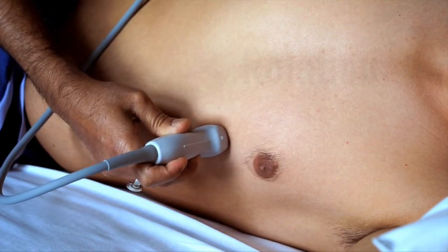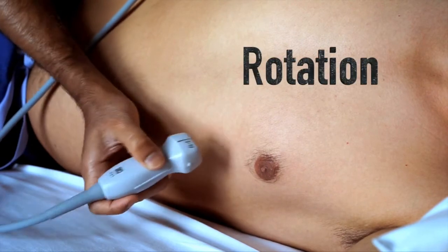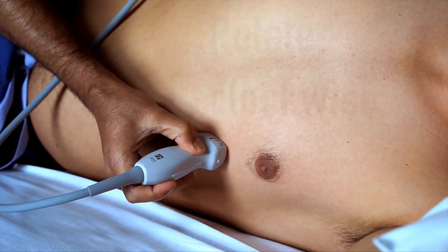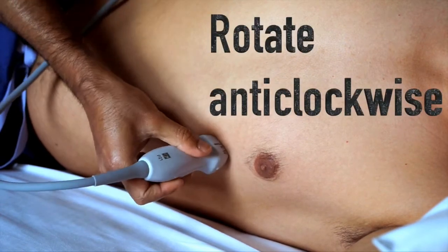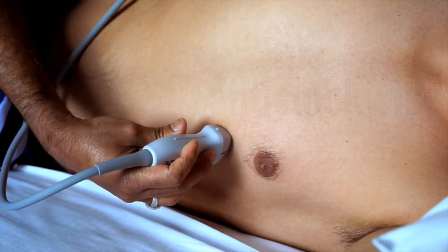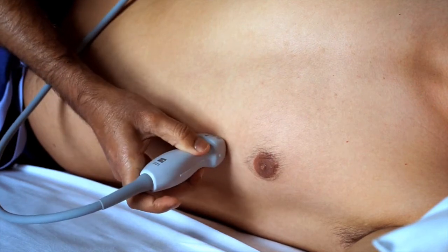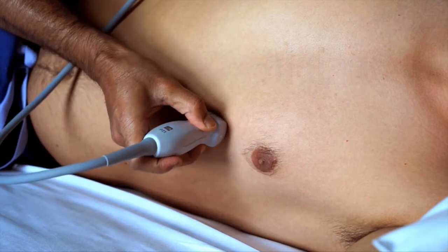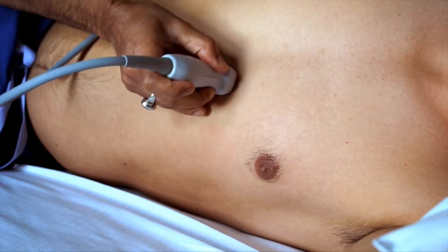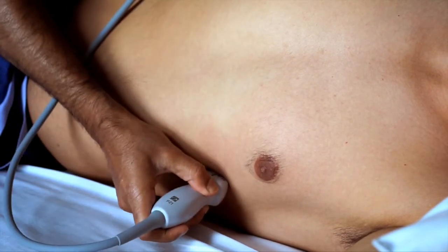The next is the rotation of the probe. Now the probe can be rotated, you can say clockwise or anti-clockwise motion. And the last, which many people say, is about the sliding of the probe, which is on the patient's skin. So you're sliding towards one side or sliding towards the other side.